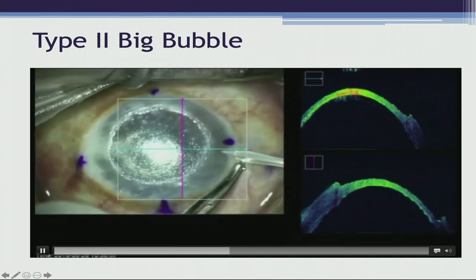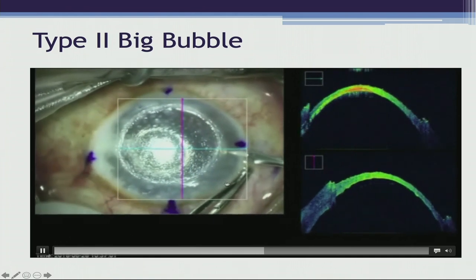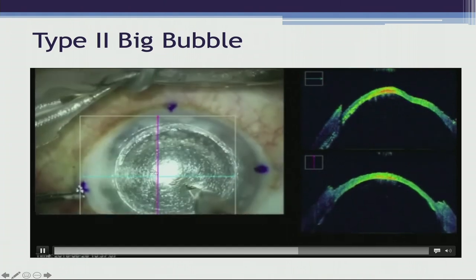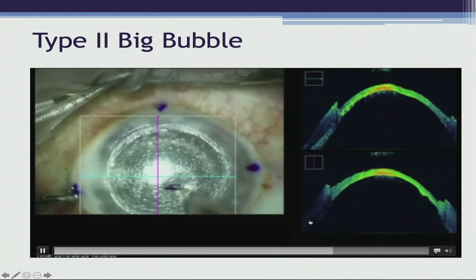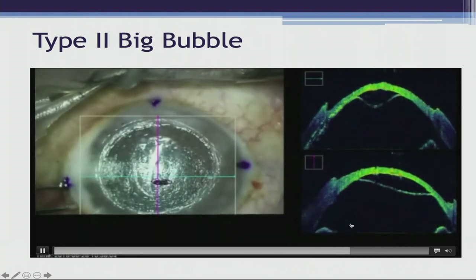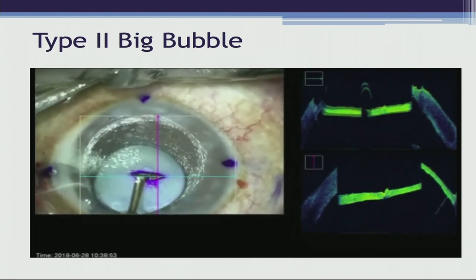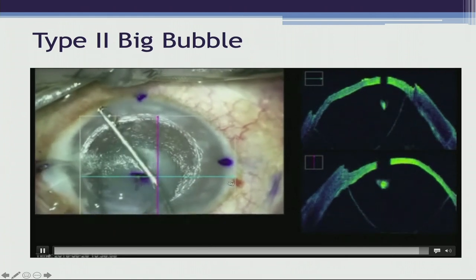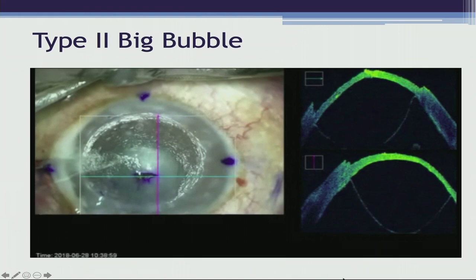So after doing this paracentesis, notice that the configuration of this air bubble will change, because actually there are two bubbles here, type 1 and type 2. And then as you give a nick in the overlying stromal layers, this bubble will move extremely fast, as opposed to a very slow movement of the bubble with the type 1 when you cause the egression. And again, like in the previous case, one can put the viscoelastic, the Descemet's membrane Dua's layer complex drops down, and then the dissection can be done.